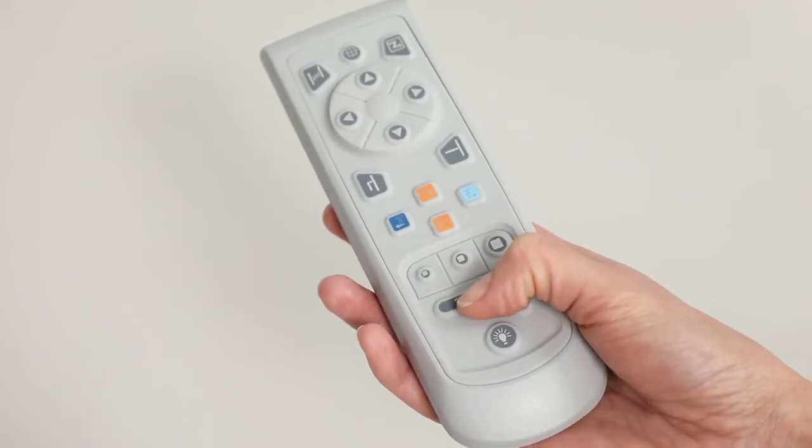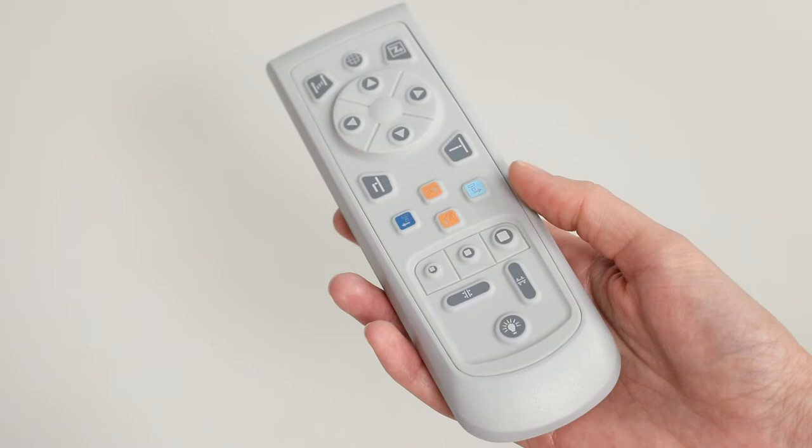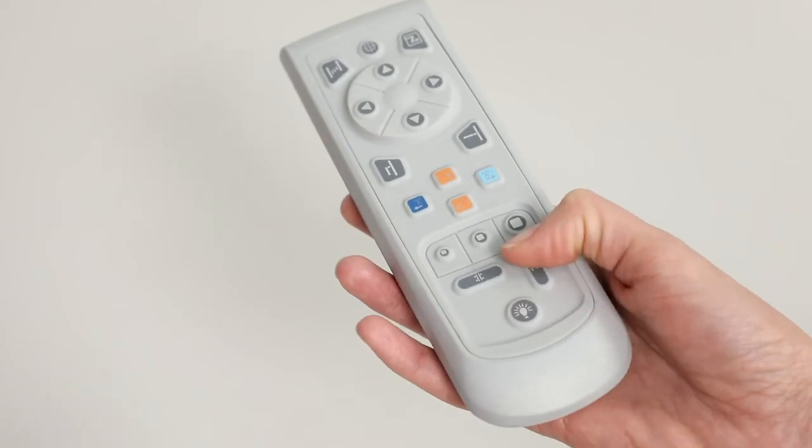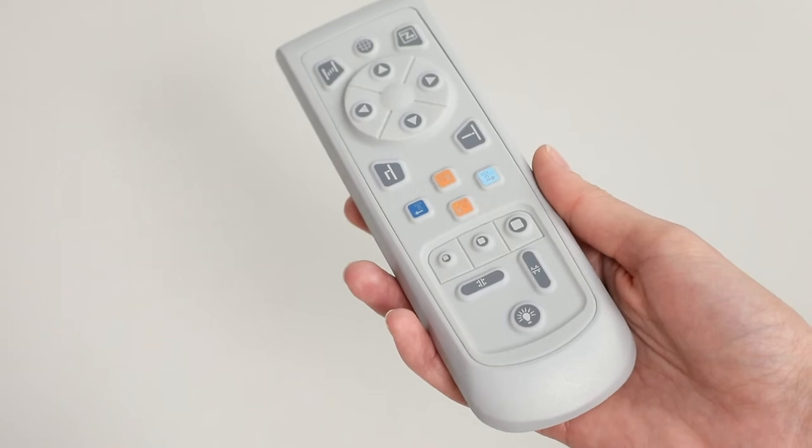A wireless or tethered remote control is also available. The redesigned remote now controls tube head movements and also collimation adjustments, great for a last-minute positioning check before exposure from within the control room.